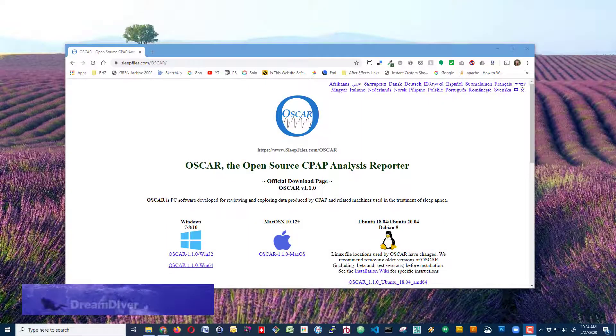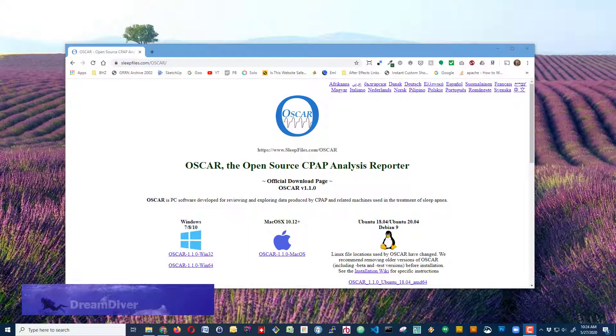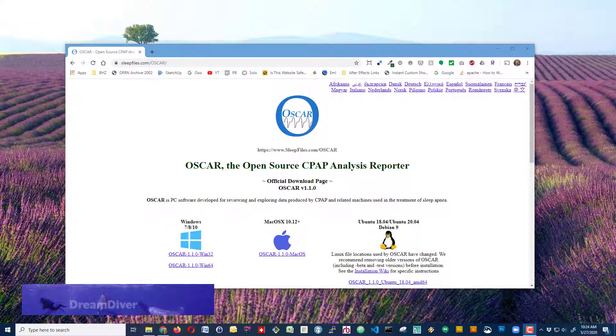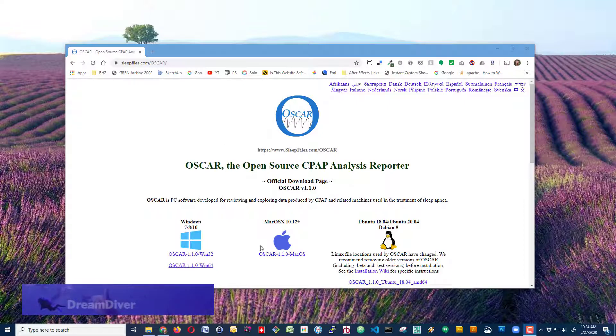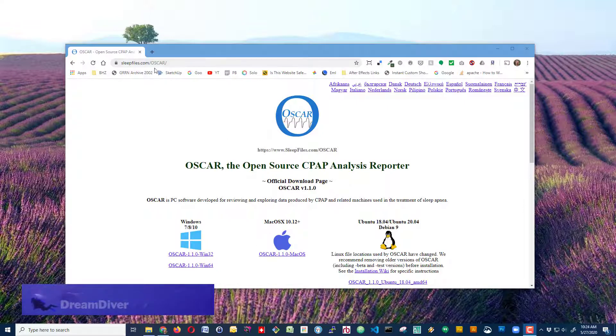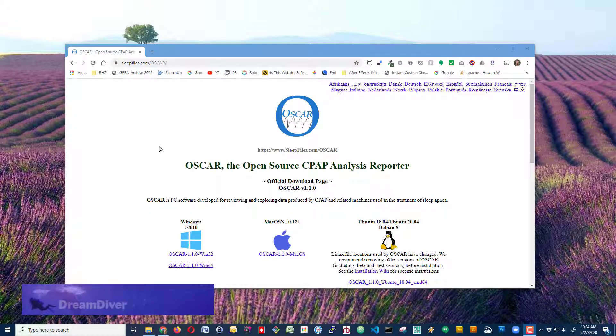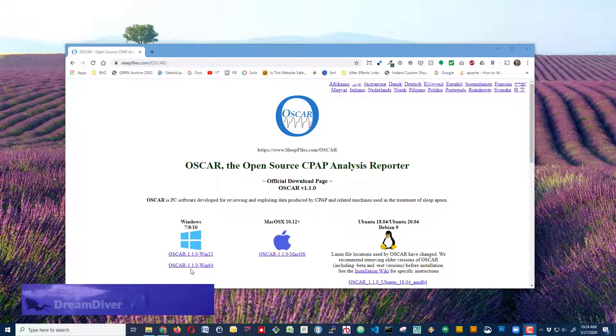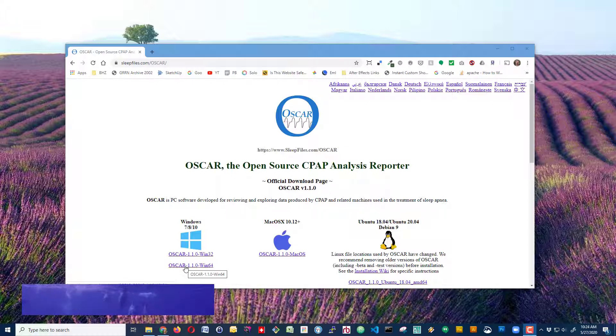Hi, this is DreamDiver. Let's download and install OSCAR. First, go to the OSCAR website, sleepfiles.com slash OSCAR. Then, download the version that you need. I'm going to download the Windows 64 version.